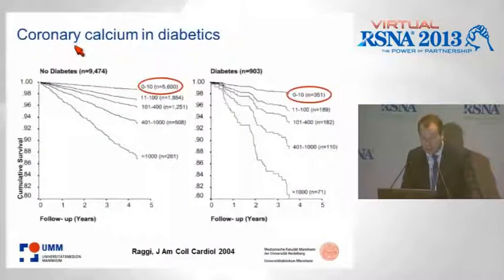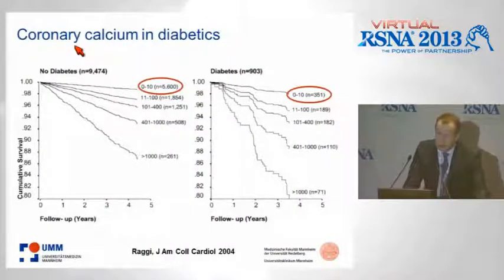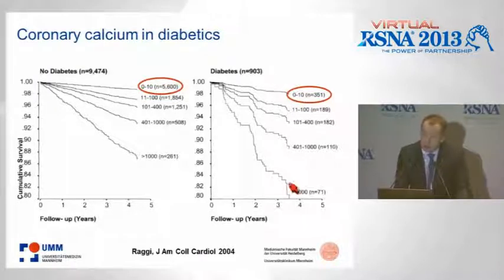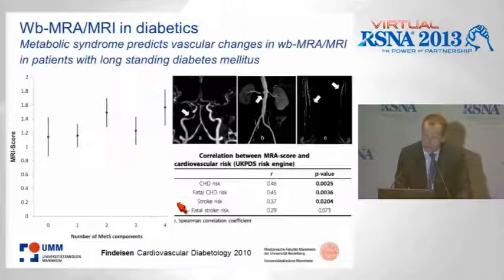had long-standing diabetes. Now we know that there already are biomarkers in diabetes, which is the coronary calcium score. Calcium score, already in the asymptomatic group of us in the general population, is very predictive of cumulative survival in terms of the total burden. And this just becomes even worse in diabetics, separating out different groups with different survival based on their total calcium load in the coronary calcium score.